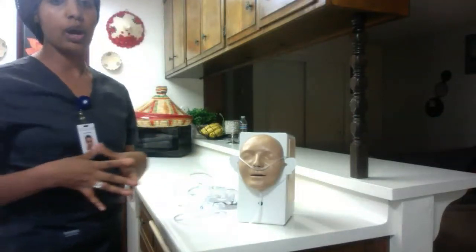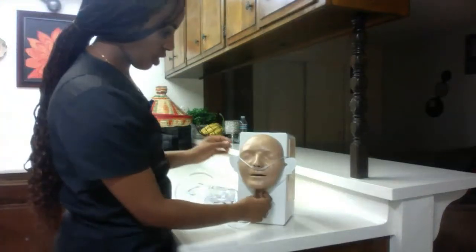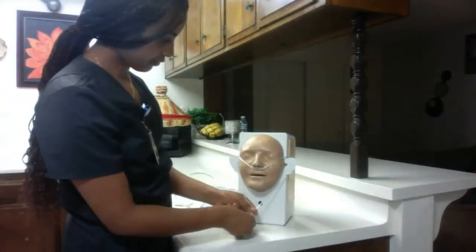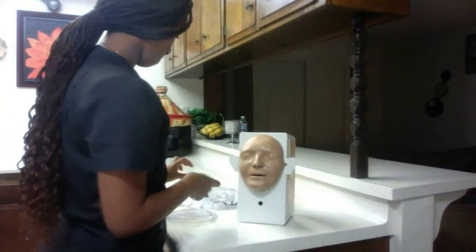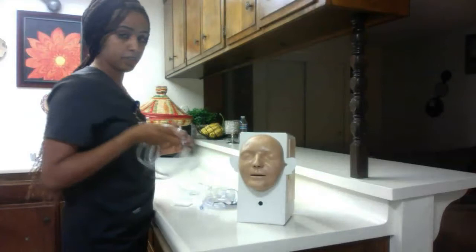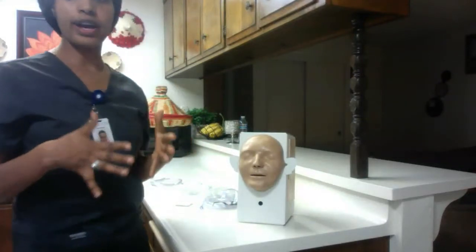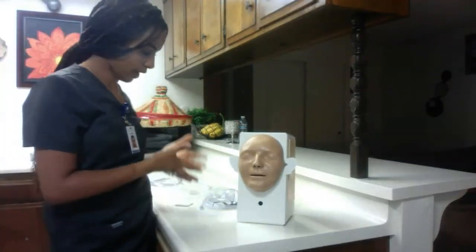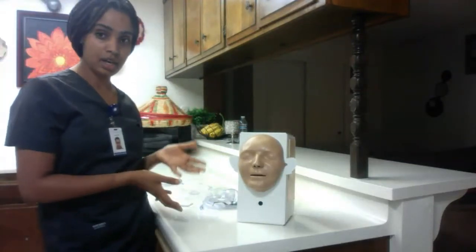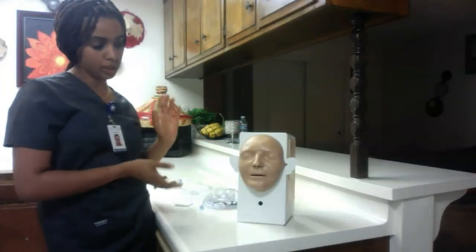Now I'm going to go ahead and show you how to put on the mask. I'm going to take the nasal cannula off, and after each patient's use we're going to discard this. Now I'm going to explain why we need to use the mask and why we're not using the nasal cannula.